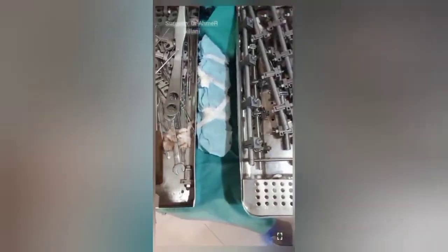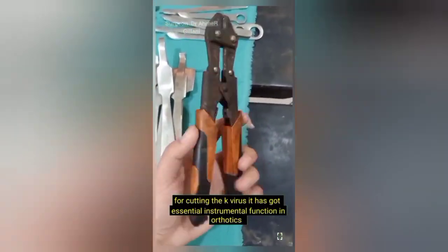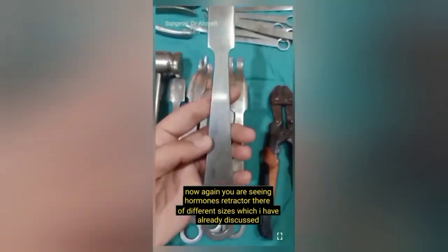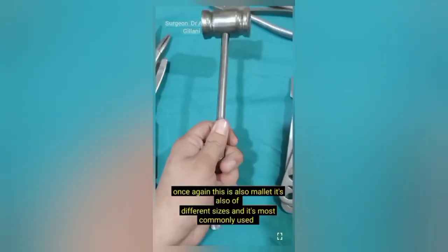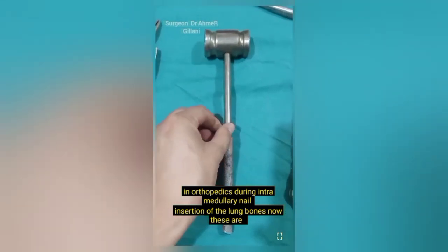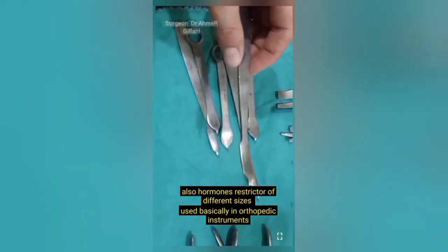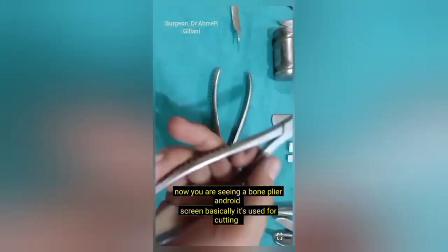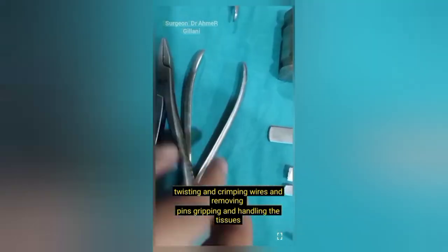This is the most basic set of orthopedics. On the screen you are seeing the wire cutter, used for cutting K-wires — it has an essential function in orthopedics. Now again you are seeing the Hohmann retractor, which comes in different sizes. The mallet is also of different sizes and is most commonly used in orthopedics during intramedullary nail insertion of long bones. Bone pliers are used for cutting, twisting, and crimping wires, and for removing pins, gripping, and handling tissues.